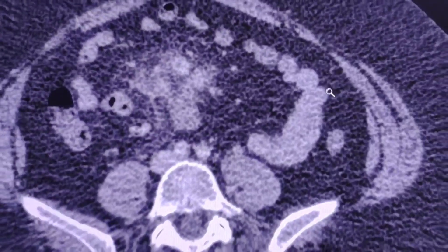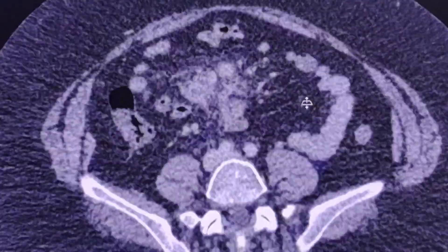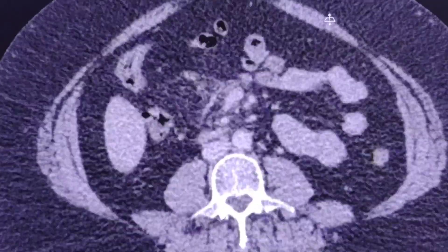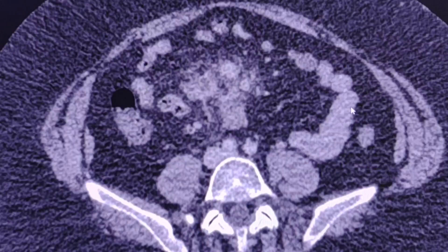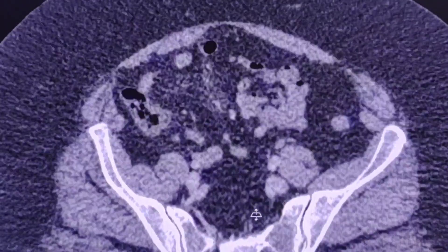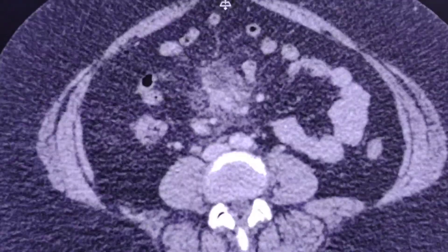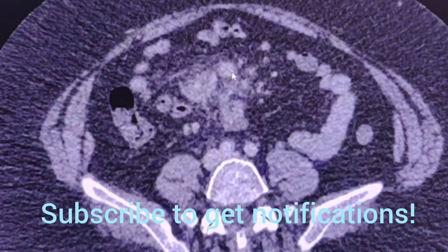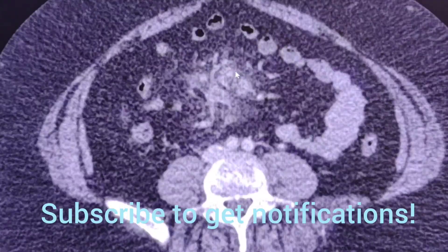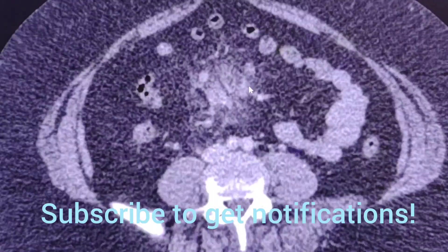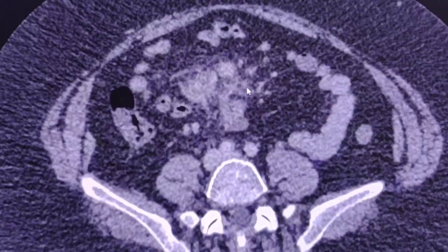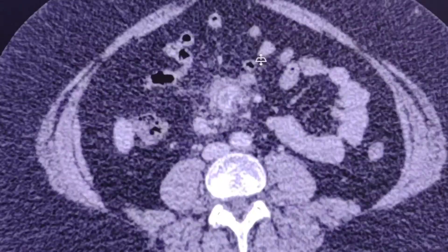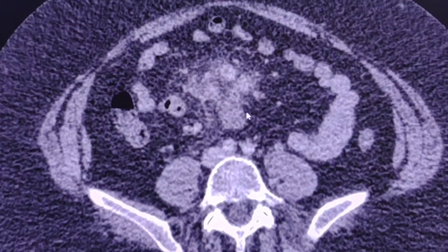A CT scan of the abdomen was performed. The only serious finding was this: in this region we can see that there is ill-defined regional fat stranding, misty mesentery — all this area is abnormal. Additionally, we can see some lymph nodes which are enlarged, with a nodular appearance. Another one, probably this one, has ill-defined borders surrounded by fat stranding. So this is a typical case of mesenteric paniculitis or sclerosing mesenteritis.